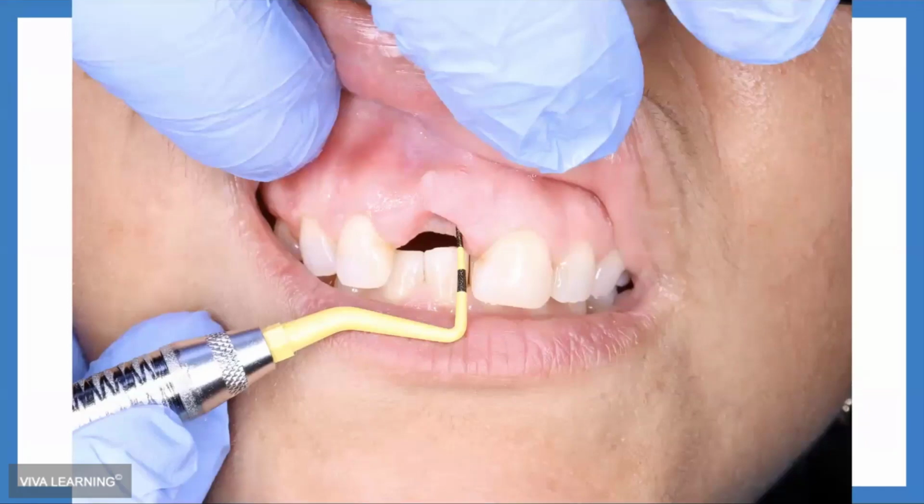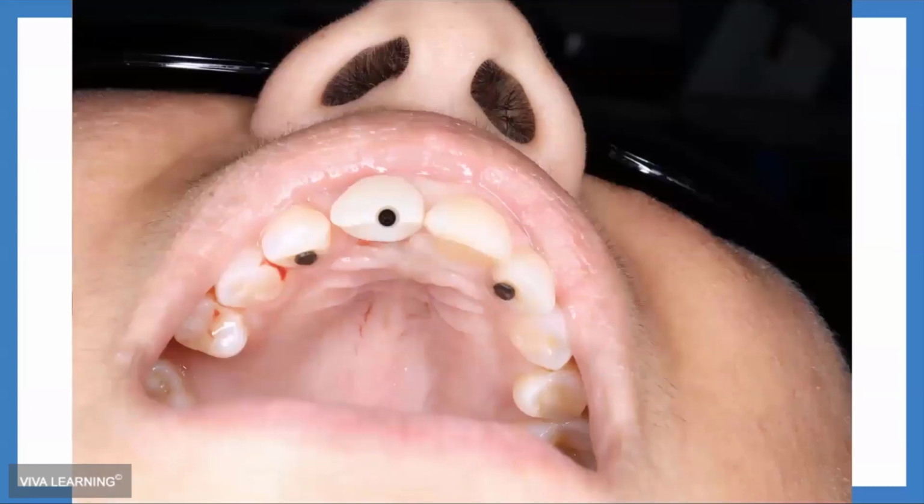So when they come in, I don't want to glue it to the base because then it's stuck to the tie base. So I double check my measurements. Like, am I at least 3 millimeters underneath the soft tissue? Because I picked a 2.5 tie base for this case, and I don't want to be showing gingival margin. I don't want to strip my gingival margin to show the metal collar of the tie base.